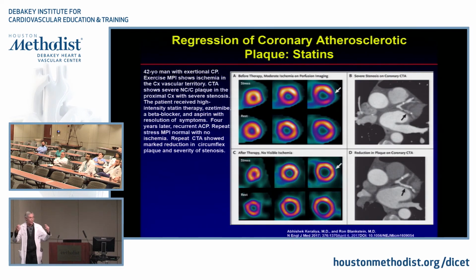Now, Dr. Quinones brought up this important question of reproducibility. So my answer to you on that is that software programs have still not been optimized in terms of looking at total atherosclerotic burden. In terms of looking at specific regional plaques, yes, but not in terms of looking at atherosclerotic burden. But what is generally speaking done, like the article by Zeb, is that whatever the software program they use, it's reproducible. So you go from one study to the next study. Now, it may not be necessarily accurate, but it's definitely reproducible, as programs tend to be, right?